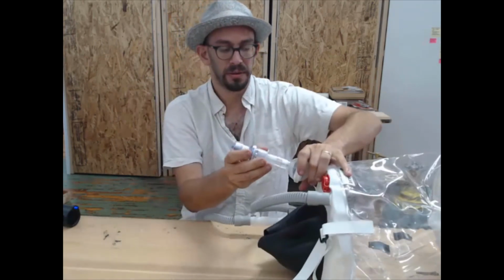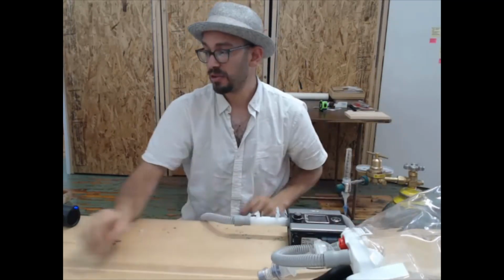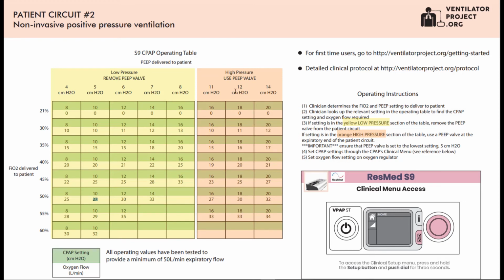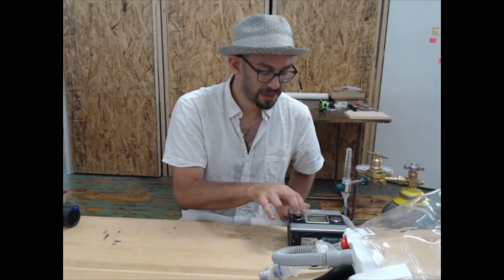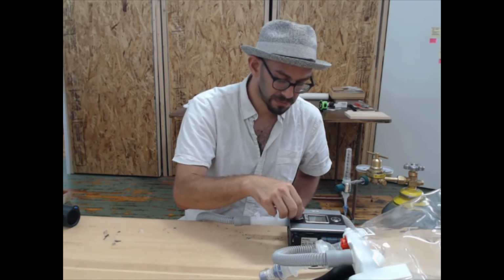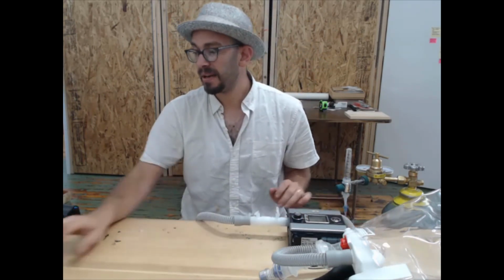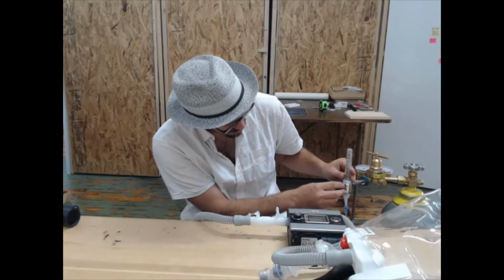Take the PEEP valve, put it on after the viral filter, and let's now pick a treatment parameter we want to give to our patient. So let's say I want to now deliver 12 centimeters of water pressure at 50% FiO2. So I go across 12 and 50, and I find these two values, 18 centimeters on my CPAP. So I'm going to go ahead and go into the clinical menu and adjust the PEEP to 18 centimeters of water pressure. Start it up, and 30 liters a minute rather, of oxygen. So now we're at this operating point for our patient.